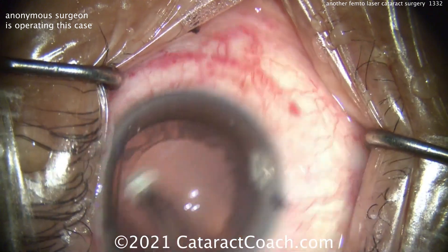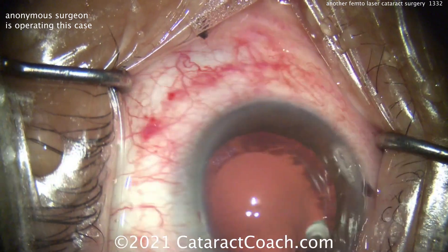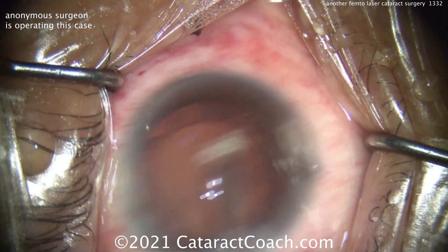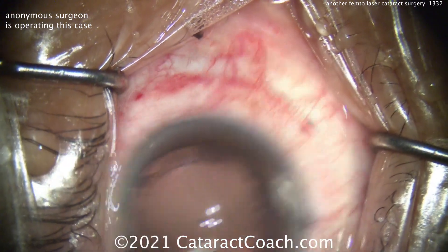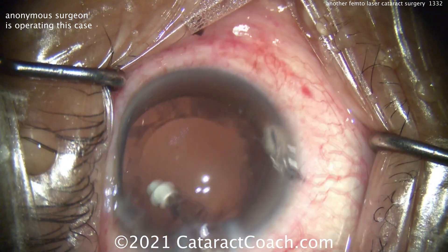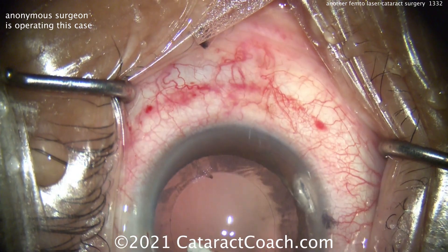It looks like a lot of polishing there — I'm almost getting seasick watching this, but I admire the effort to really polish things up. But remember, don't break the capsule — it's only a four-micron-thin capsule. That's pretty aggressive on the posterior capsule polishing. But if it's my eye, don't pop the capsule. You can see that anterior capsule needs to be polished as well.